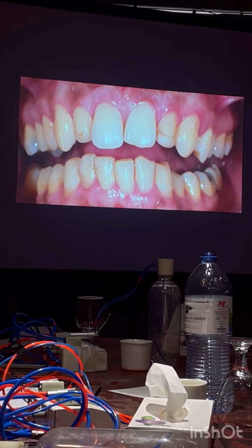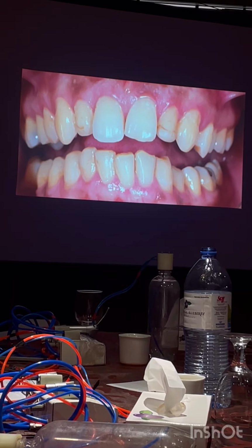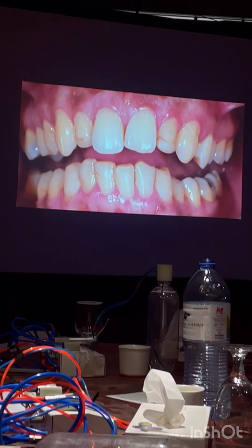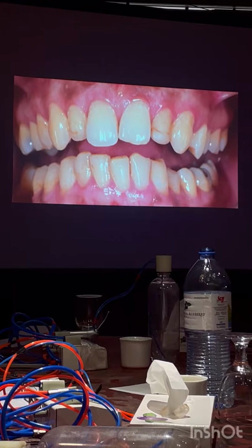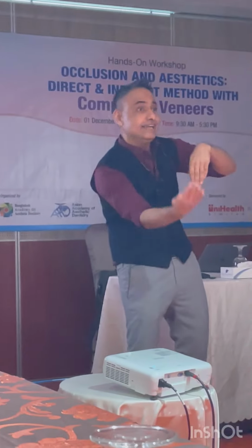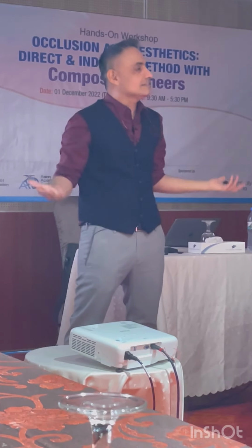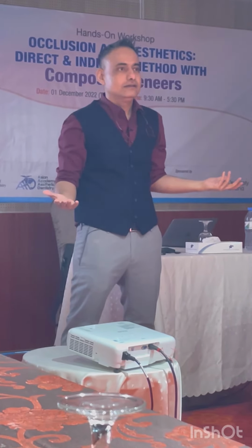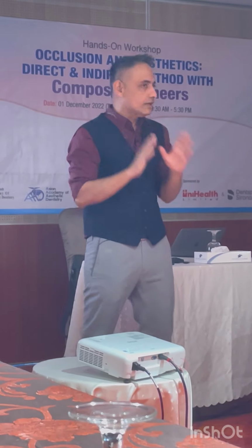This is not how you do. You cannot apply your adhesive on the polished or the finished surface of your composite. Never. Why? Because all your adhesives have fillers in them. Please remember. Okay, your surface is not very smooth, and you're adding still more a rougher adhesive which has fillers in it. So the surface is getting even rougher. And now this resin will stain over a period of time. So never do that, okay?